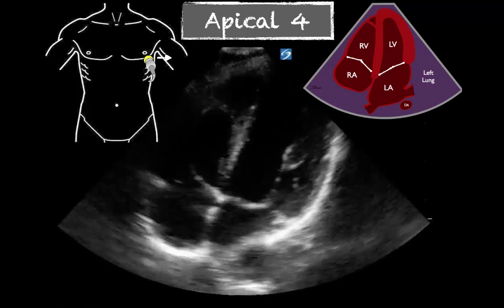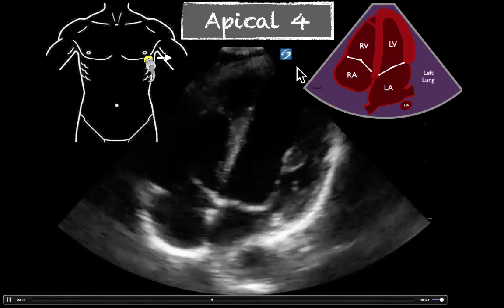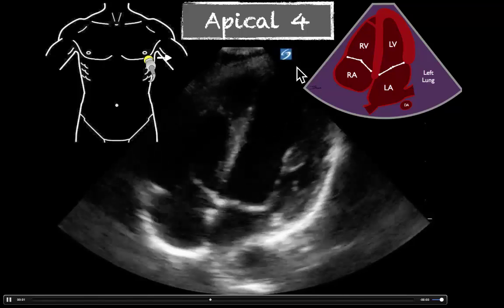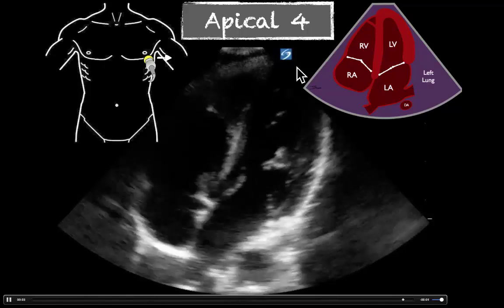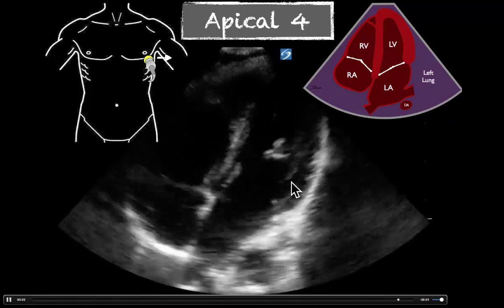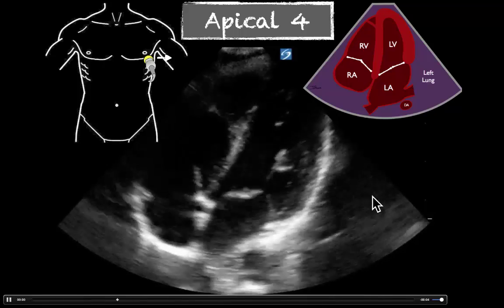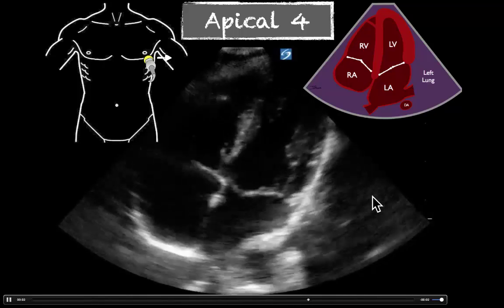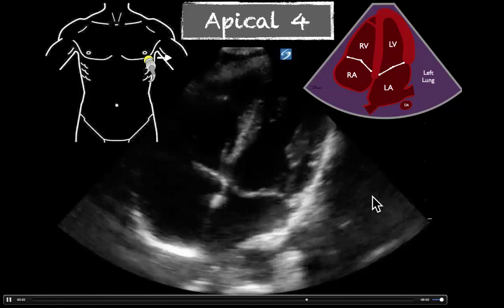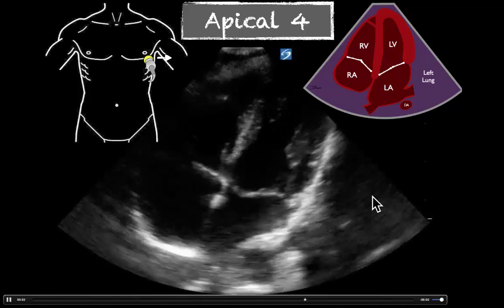Last but not least, we've got an additional example here. What we could do to improve this image is drag a little bit to the patient's left and aim back towards the manubrium a little. That would get it to stand up more like the last two examples. But we can see here that the chamber is decreasing well in size and that the anterior leaflet of the mitral valve is slapping up against that wall, which is that secondary sign of a good ejection fraction. Go ahead and bring these into your mind of what a normal ejection fraction looks like at the left ventricle.